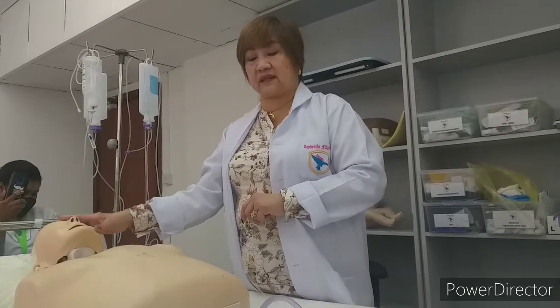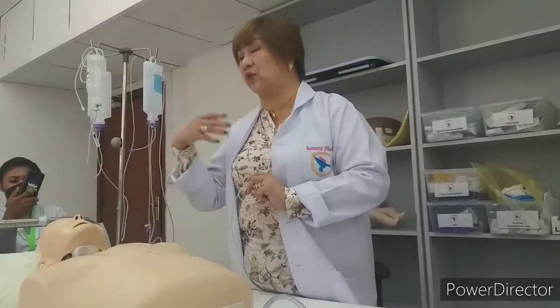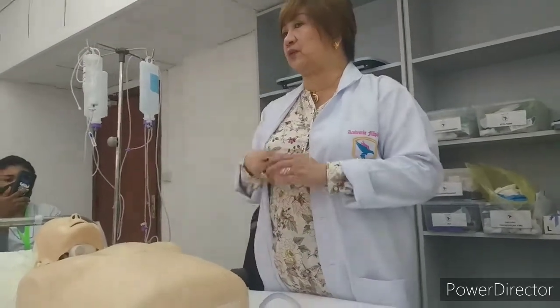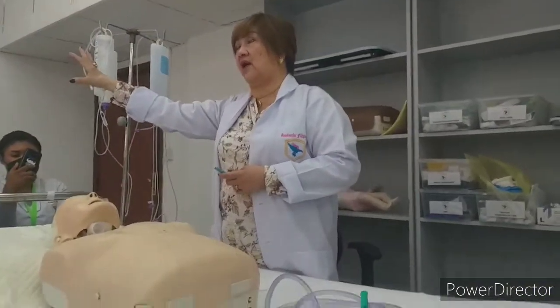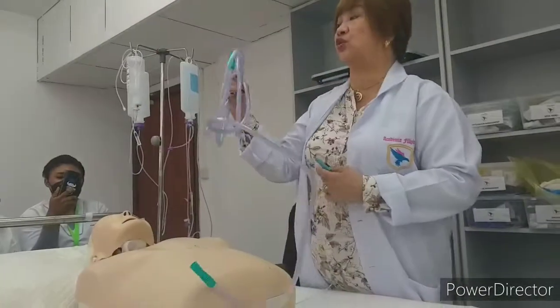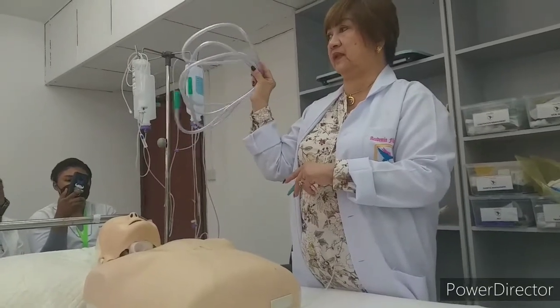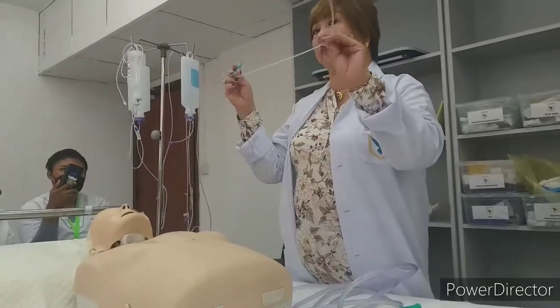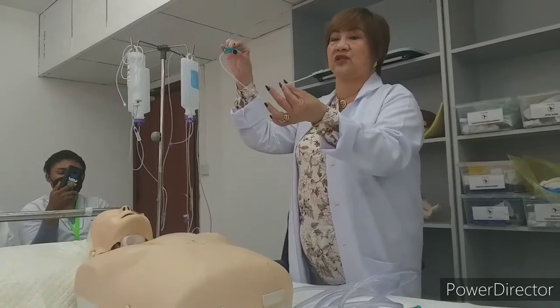So this is why we do it, and how we will do it now is we need equipment. What we need is a wall-mounted suctioning machine. In that wall-mounted suction, we will need 2 suction connecting tubes. This is the connecting tube. We will have an appropriate suction catheter. So this is the suction catheter.